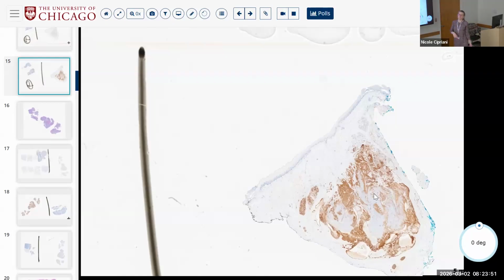The other thing you could think about is one of the INI1 or SMARCB1 deficient neoplasms. But if you're in a salivary site, you're mostly going to be dealing with this. But yes, depending on where you are and what the morphology of the plasmacytoid cells are, you can always think about something like a rhabdo or a chromatin complex remodeling INI SMARC deficient tumor. But this is so low grade, and in this context, I wouldn't.